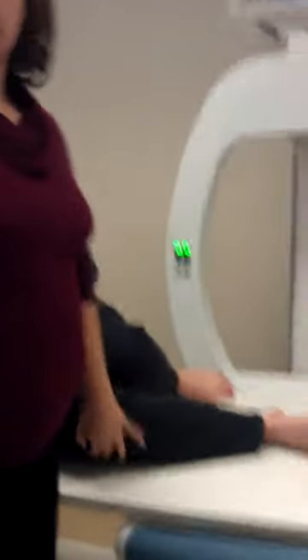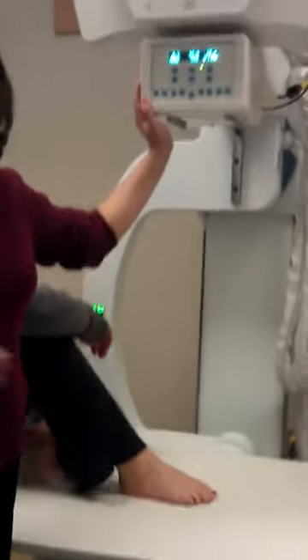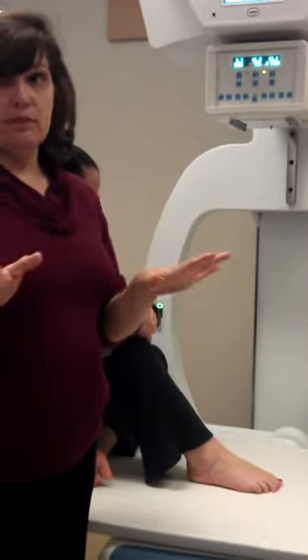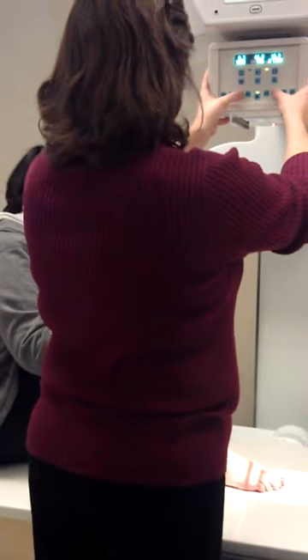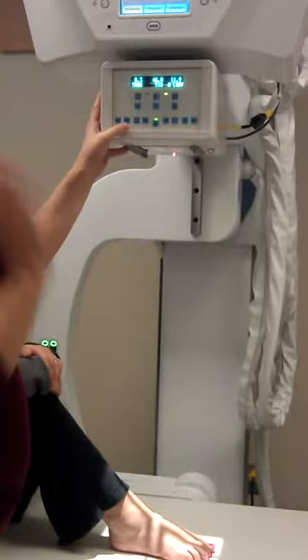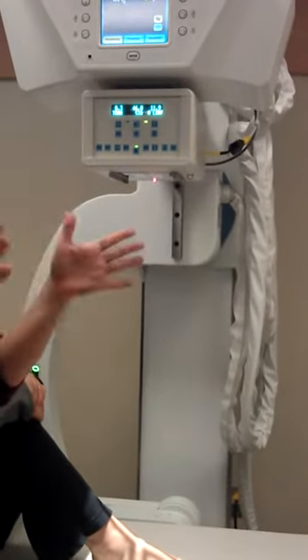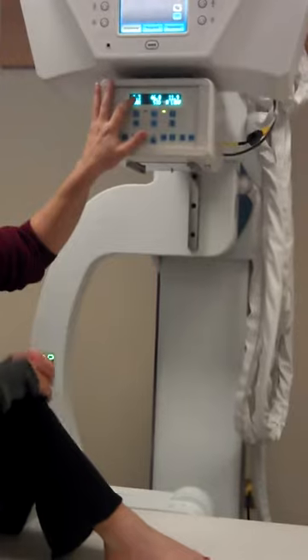If we're doing the AP flip — so AP flip is done on a 10 by 12 lengthwise, and I would divide my cassette in half. Now we can adjust her foot. See, this is at 12 — we're close to it, 11.9. I'm not looking for 12 on the dot, but you're in there, close to it. And this should be a 10, but I know I'm dividing my cassette in half — if it's 10, half's 5. I don't have to go all the way out by 10.